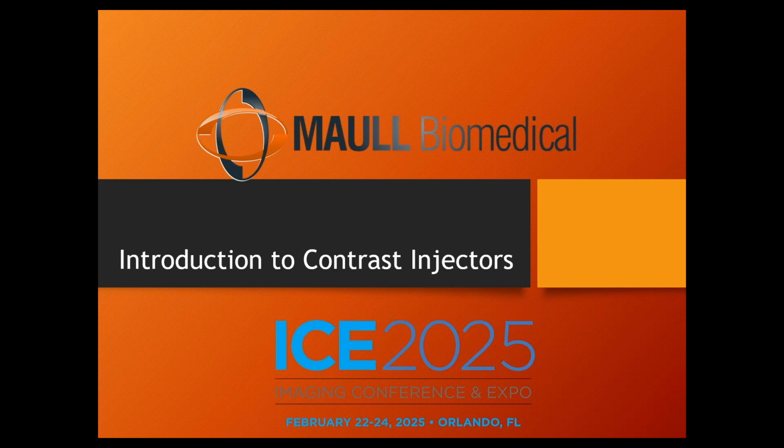Now, blood vessels are neither thick nor dense. Even a weak X-ray photon has no trouble passing right through a blood vessel. So that's why blood vessels don't show up on X-ray images, because they're not thick or dense. They just get blacked out. Most of the time the doctors don't care. Get an X-ray done, we're looking for broken bones and stuff like that. But sometimes there are instances where we do want to see the blood vessels. That's why we're doing this.